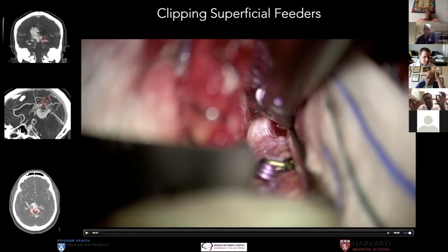Okay, the color is different, and I'll remember to point that out. The artery is more salmon colored. The vein is a little more, it's not that the blood is a different color. It's the actual tissue, because the vein is thinner, you see a darker kind of tissue. The way it bounces is different. The veins are often wider. The arteries are more narrow.